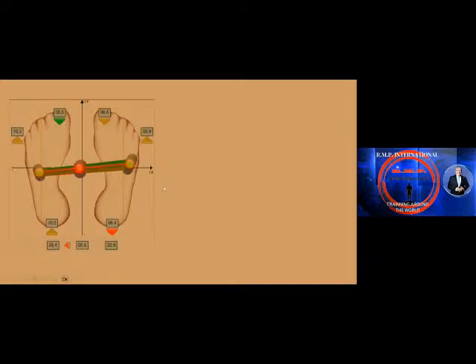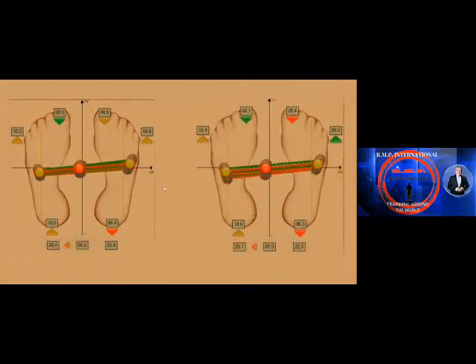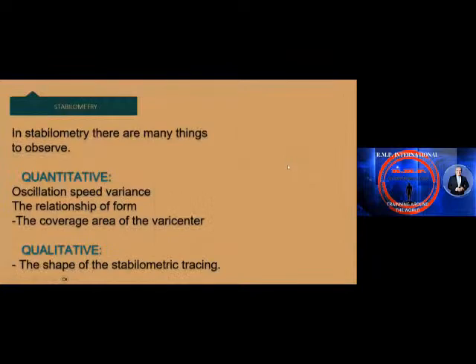Look here, 5.5. And look here, 7 kilos when closing the mouth. Here, the craniofacial system is the cause of the alteration. With a simple test, you can make the diagnosis.